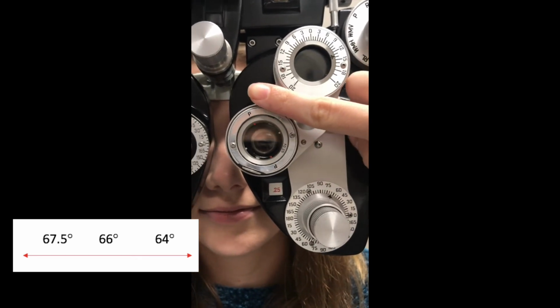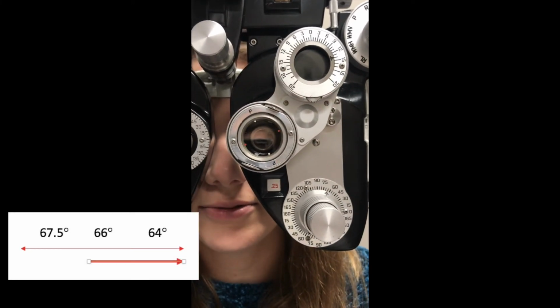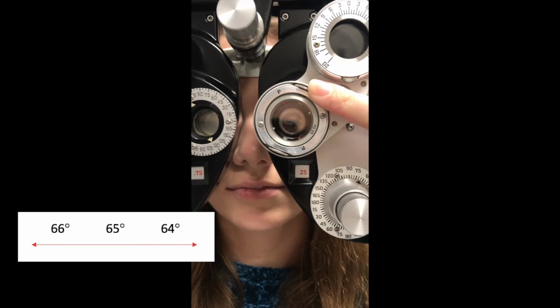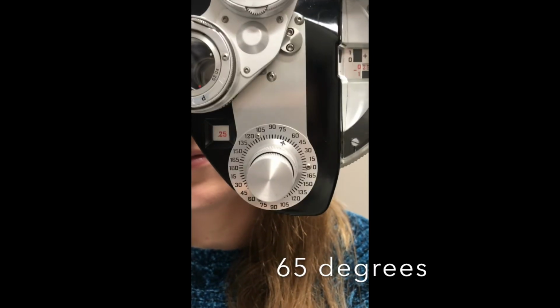All right, option 1 or option 2? Option 2. Option 1 or option 2? They're about the same. Okay, it looks like we have refined our axis.